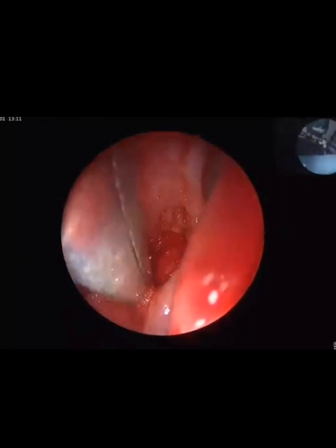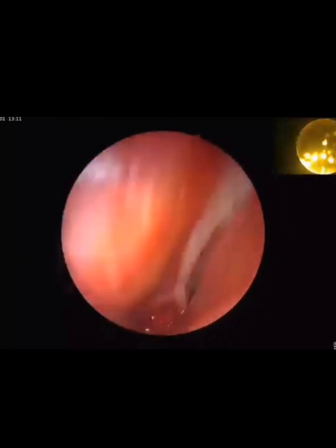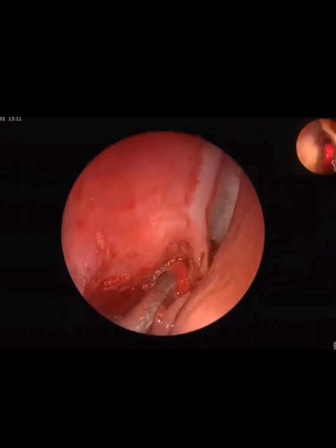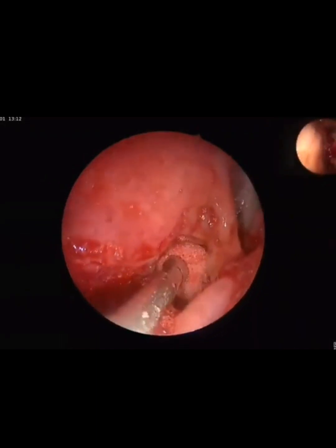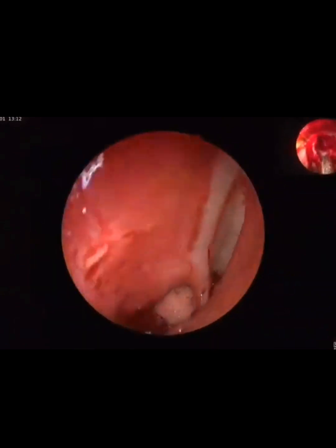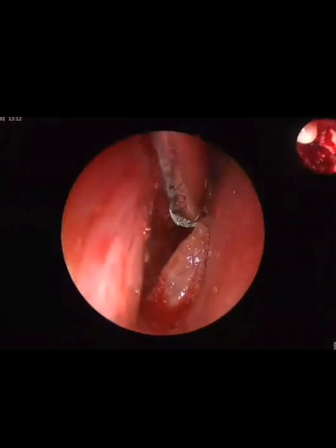Now I will use reverse cutting to clear the area just superior to the anterior ethmoidal artery. And the anterior ethmoidal artery part I will keep at last. Then don't push Merocel inside the frontal sinus too tightly. Otherwise it will slip laterally and it's literally difficult to remove at the frontal sinus. Any confusion?